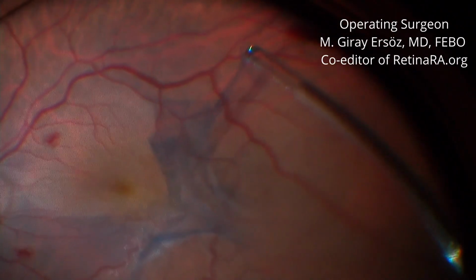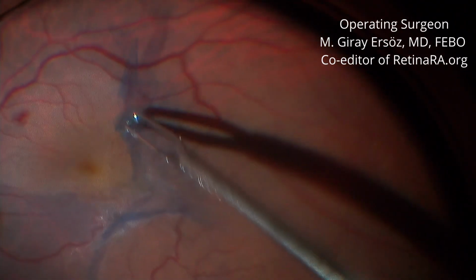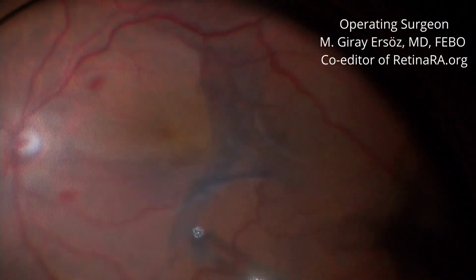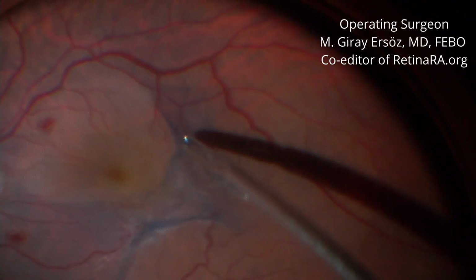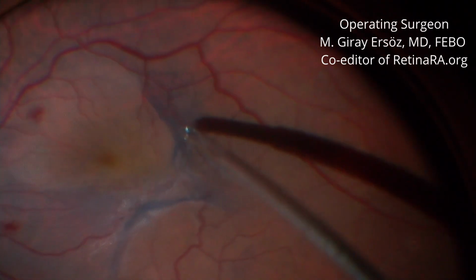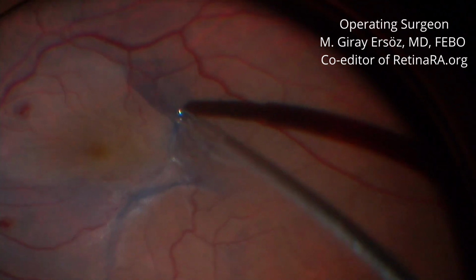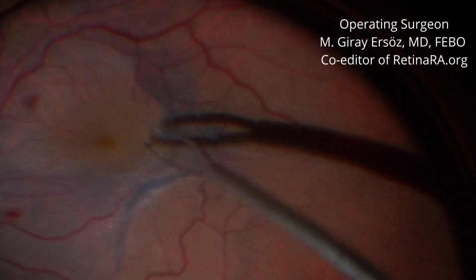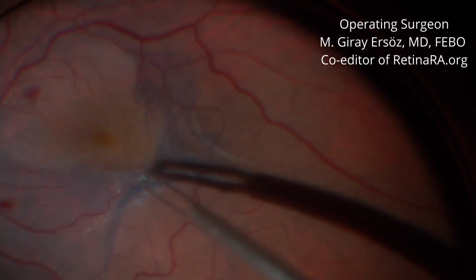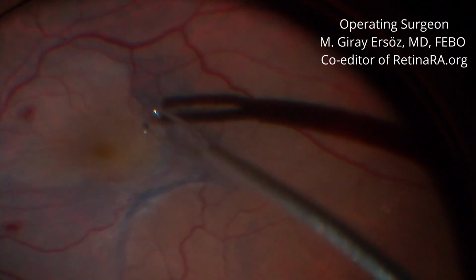In regions where traction was excessive and the membrane appeared tightly integrated with the retina, I avoided aggressive peeling. In such cases, when I observe resistance during peeling, I often move to another area, continue peeling there, and later return to the previous site. With time, the interface between the retina and membrane becomes increasingly hydrated. This hydration allows subsequent peeling after a brief interval.